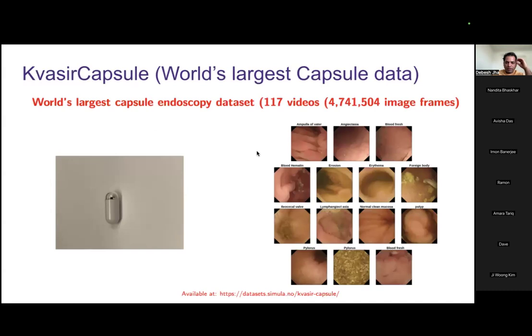And then we also applied some effort to video capsule endoscopy. The main problem I want to highlight is, let's say you have a video of 1 hour or more, sometimes even 8 hours, because usually patients wear this camera and it records for 8 hours.